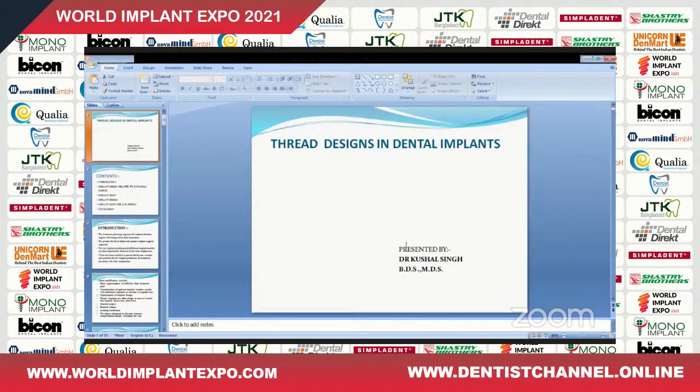Okay, let's start. The thread design is very important in dental implants. We often do dental implants, and our colleagues have been doing this for a very long time. Everyone has got to know about the designs of implants. There are various design patterns, regularly updating over time. At first we started with transosseous implants, then came the basal and cortical implants. Nowadays we have some more implant designs, which make it much easier for us to do such cases on full mouth, with delayed loading as well as immediate loading.